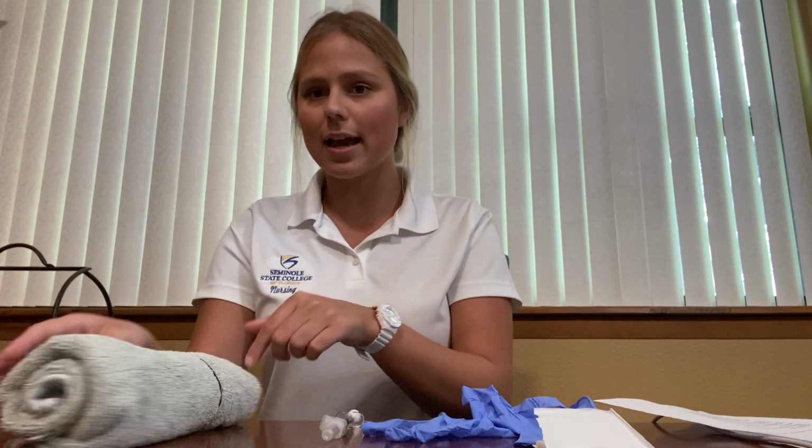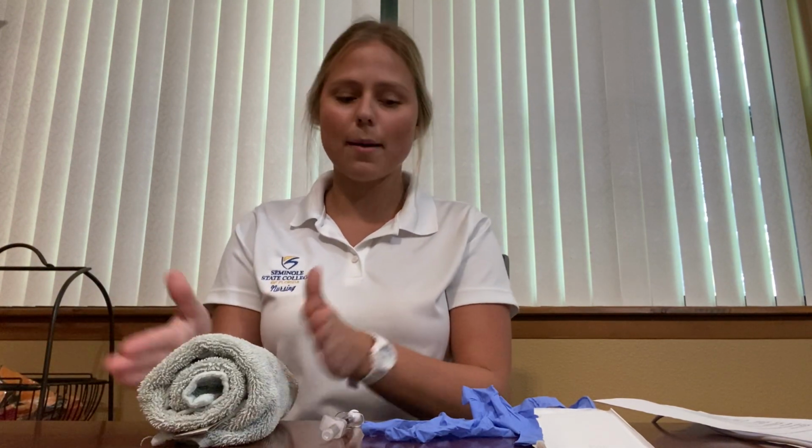So I'm going to tell her that the injection is to help improve her B12 levels, or maybe if someone has anemia. And then I'm going to do my third check. So again, I'm going to check the medication against the MAR. So I have Anna Pawlowski, right patient, right drug, B12, amount 500 micrograms, 0.5 mLs, route sub-Q, and then time 1500. So I'm going to scan Anna Pawlowski's wristband, scan the syringe, and then I'm going to position the patient properly, make sure I can access the site. I'm going to be doing the outer posterior aspect of the upper arm.